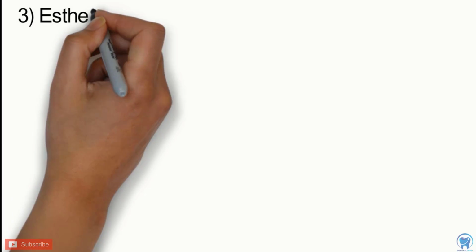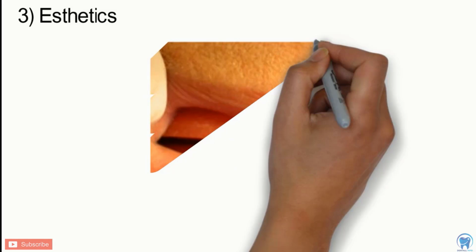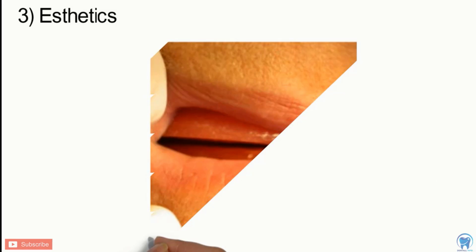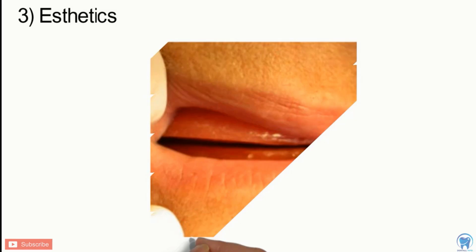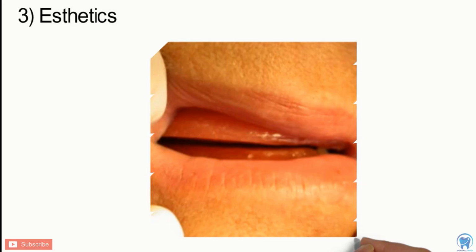The next method involves the correct development of facial aesthetics. The labial surface of the occlusal rims should be contoured to replace or restore the tissue support provided by the natural structures. If lips are not properly supported anteriorly, the tendency to increase the vertical dimension is great, which may lead to an increased lower facial height. When the vertical dimension is increased, the skin of the lips appears stretched compared to the skin over other parts of the face. The skin appears more flaccid with a decreased vertical dimension.